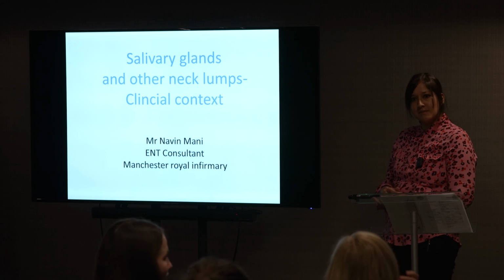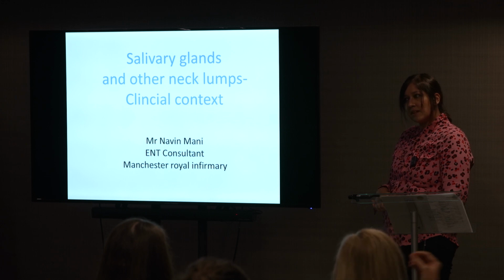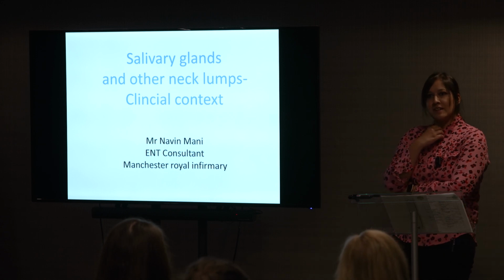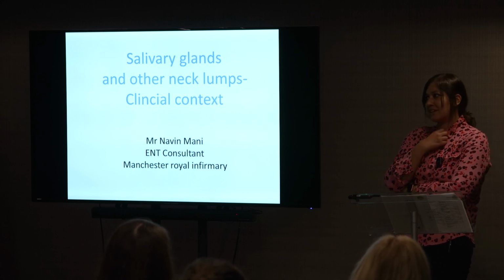No problem. And you said that you had that reactive node, then was later, I can't remember what the eventual pathology was, but is there, within radiology circles, sort of a figure for the number of benign looking nodes that turn out to be something suspicious, like there is in thyroid, like with U2s? I'd say, yeah, I'm showing the worst cases. The majority of these are actually benign, but it's better to be safe than sorry. I'm probably more of a cautious radiologist, so I'd say that probably like something like 80%, I'm just throwing a number out there, the majority of these are benign, but it's always best to be safe.